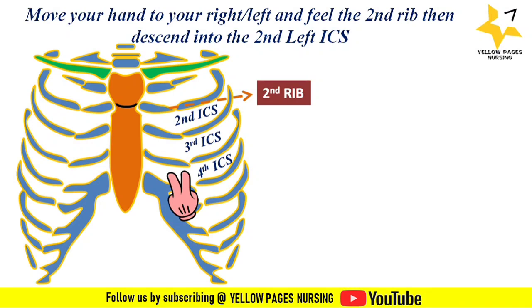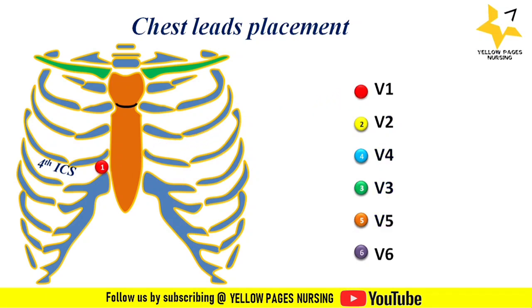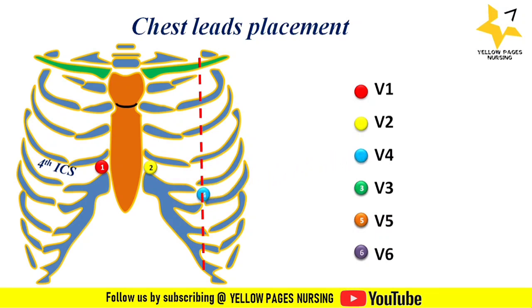V1 is placed on the fourth intercostal space to the right of the sternum. V2 is placed on the fourth intercostal space to the left of the sternum. V1 and V2 are kept close to the sternum. V4 is placed on the fifth intercostal space at the left mid-clavicular line.